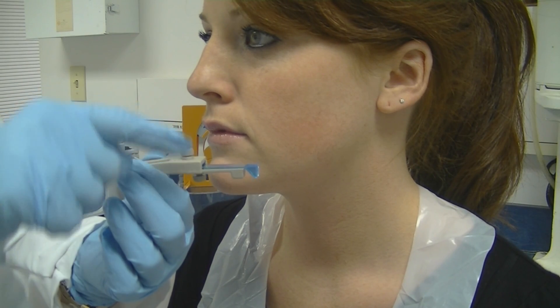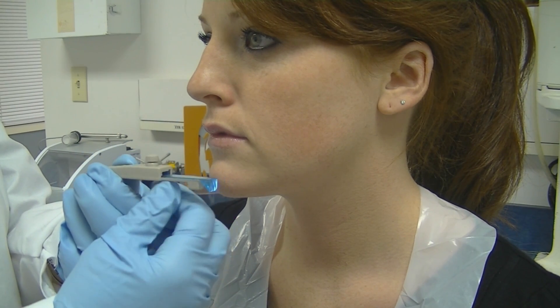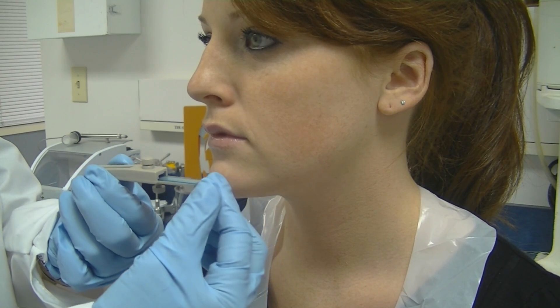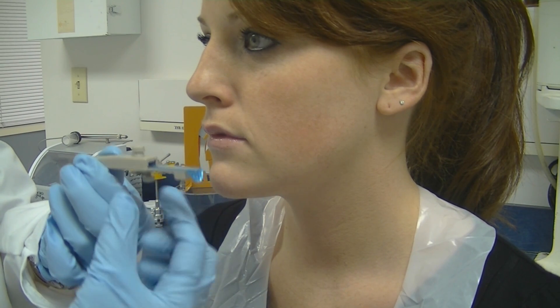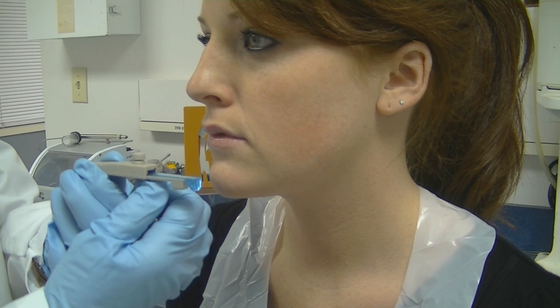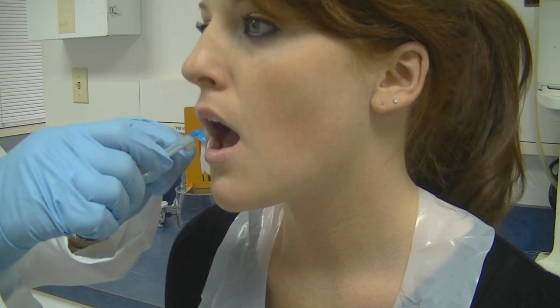The first thing you will notice are the two set screws. On the lower, you can loosen that set screw if the patient has an extensive crown and bridge where it is a little bit thicker, or malocclusions. That will allow you to adjust so it seats comfortably on the mandibular portion.